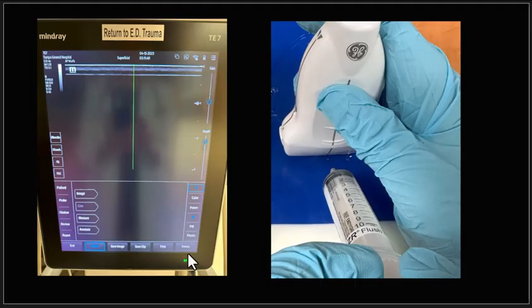So here is what that M line looks like. It'll appear slightly different on different ultrasound machines. It will default to the center of your image when you first turn it on. There is a way to drag it right to left, but we want it to be right in the center of our ultrasound image. And if our vessel is centered on that green line, then we know that when we enter under the middle of our ultrasound transducer, we're going to be heading towards our target vessel, and we'll have everything aligned up appropriately.